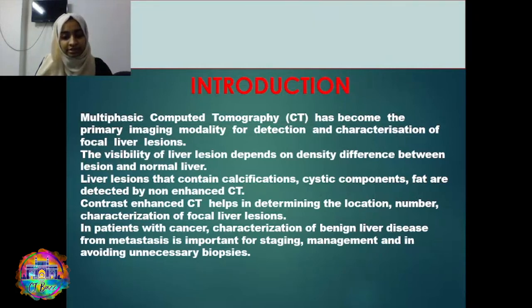In patients with cancer, it better differentiates between benign lesions and metastasis for staging and management, and to avoid unnecessary biopsies.